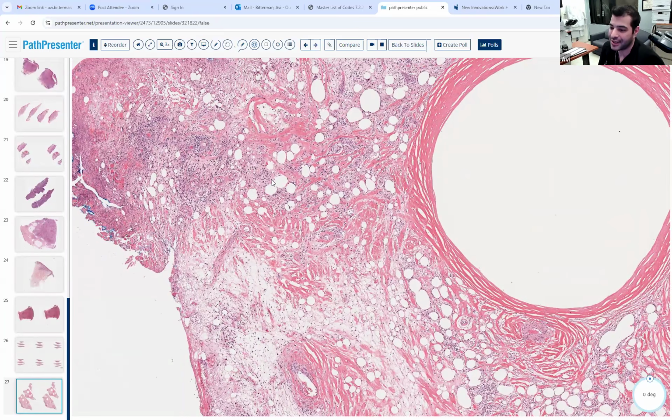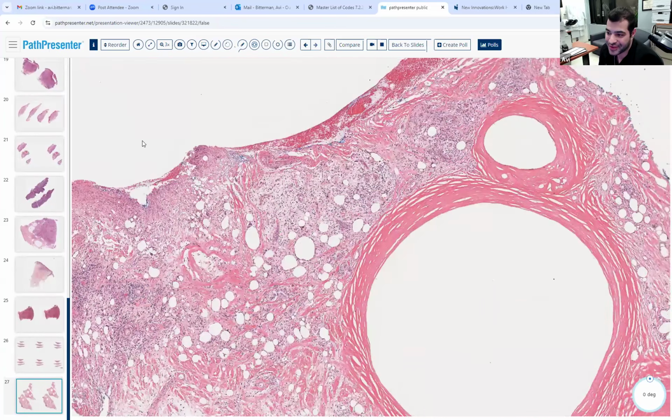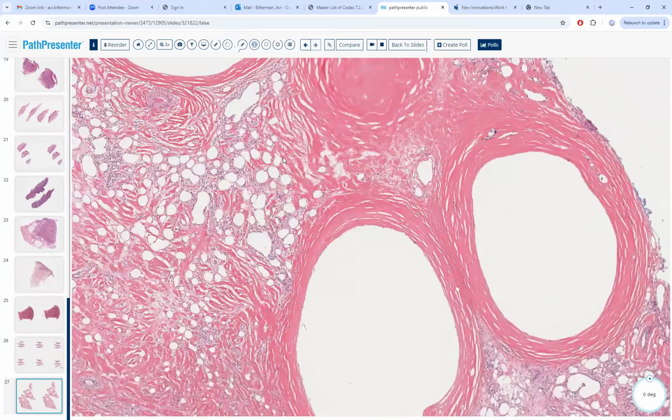What kind of locations are we going to think about this in? I remember you showed us one in the penis at one point. Yes, that's this one. And paraffin injections, or the buttocks, people do silicone implants there.